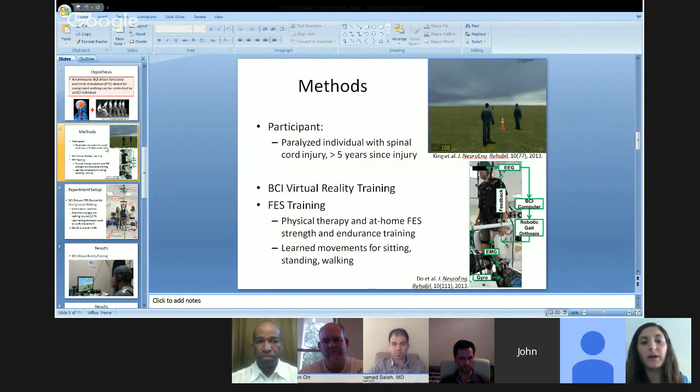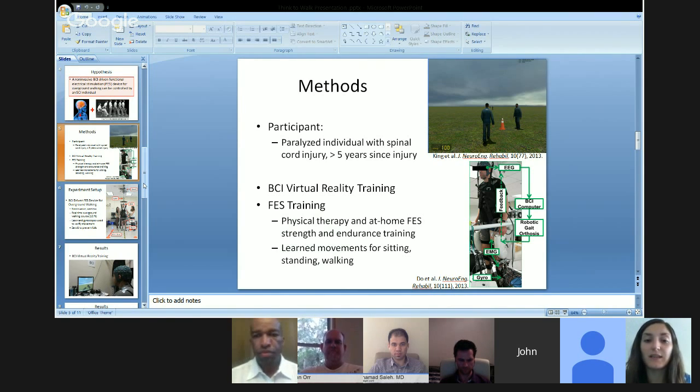So what did we do? Well, this was a simple case study where we wanted to see if we could build such a device and if it was feasible to use it in a person with paraplegia. So our participant was over 5 years since his spinal cord injury. He was my age, so late 20s, and he was about a T6 thoracic level paraplegia.